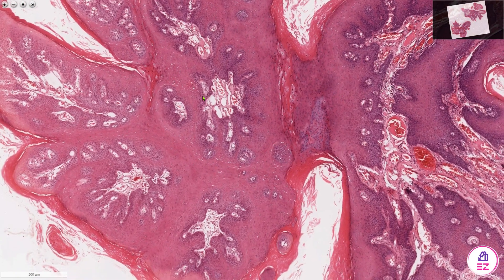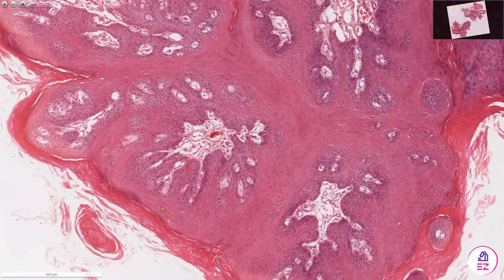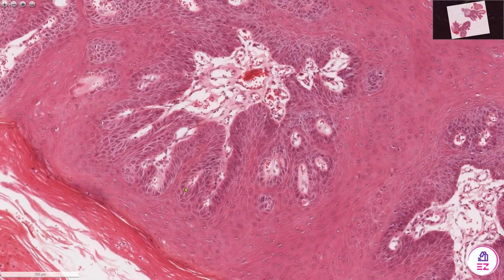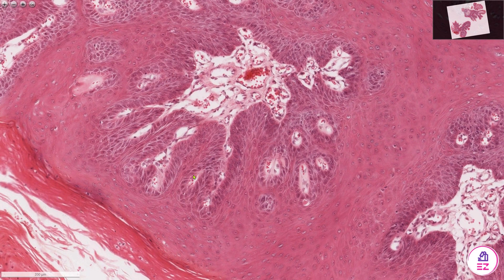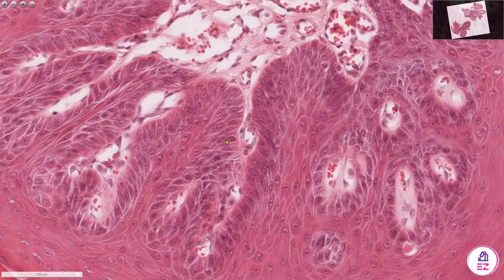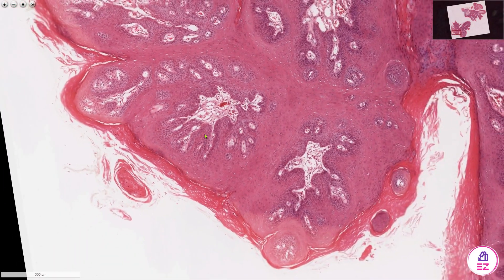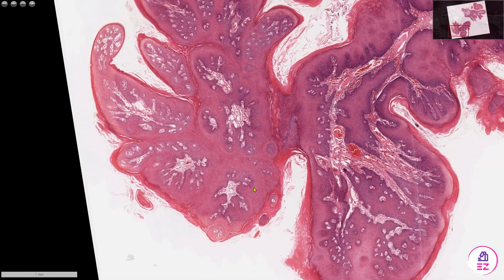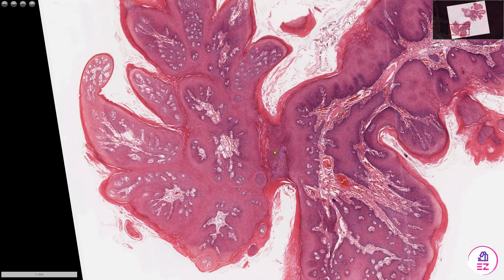Another thing to be aware of is that the epithelium associated with these papillomas can look slightly atypical. Looking at this rete peg, the stratification of the epithelial cells is slightly jumbled and sometimes you might see one or two prominent nuclei, but we would consider that to be reactive atypia rather than true dysplasia. So don't be put off if you see some atypical epithelial changes in those rete pegs, because it tends to be reactive in nature.